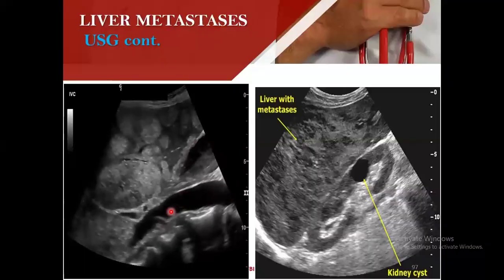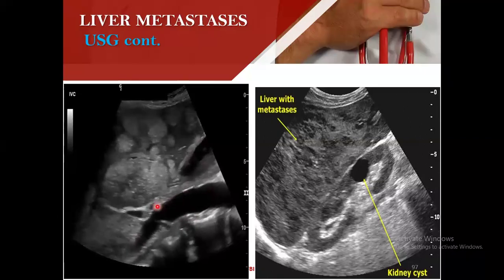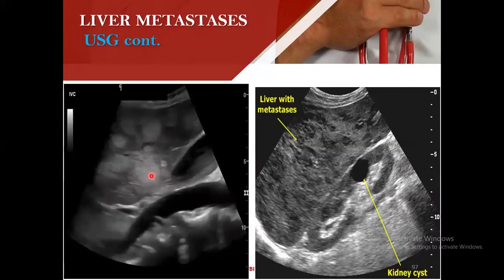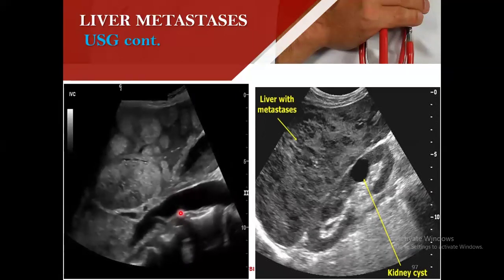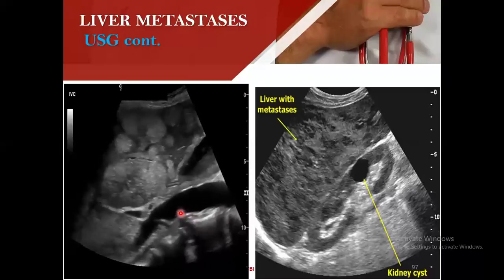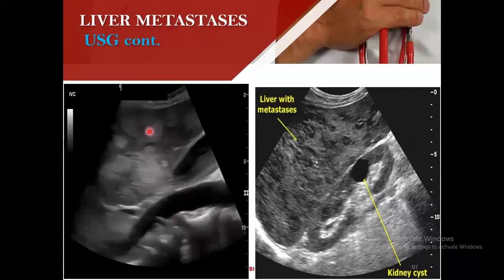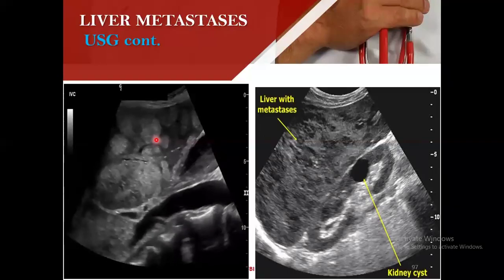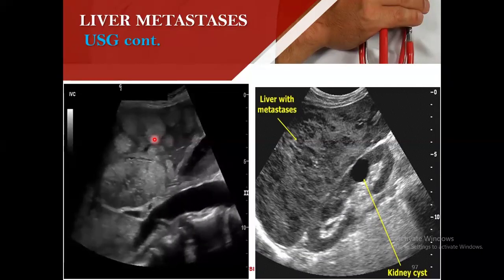This can be the inferior vena cava, though. But don't forget that the portal vein can also be enlarged like this in cancers like this one. So for you to know it is the inferior vena cava, you measure the size. And one other thing is that in cancers, in liver diseases like this, the portal vein can be enlarged, portal hypertension. So you can miss that.